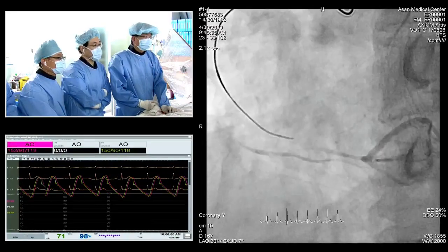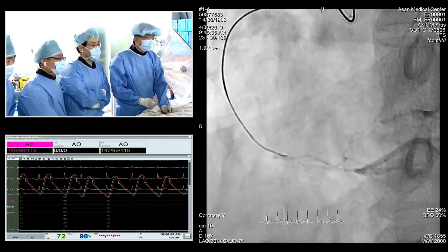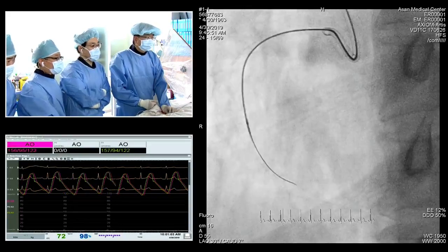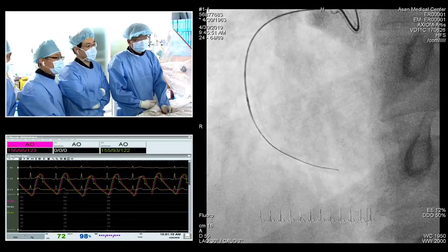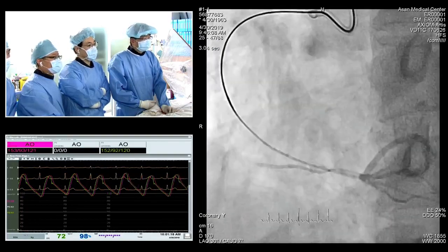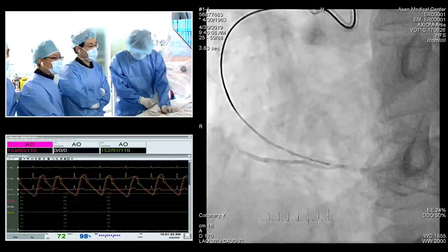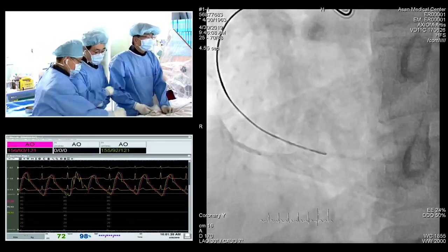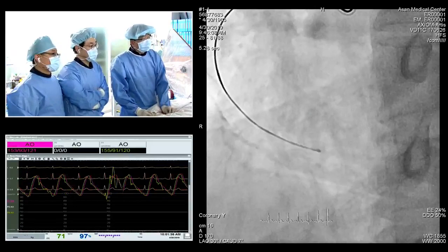Next. And at this moment, we check another projection. As you can see, there is some touching of the distal cap. At this moment, we make the direction to the lower portion. Next. And rotating the wire tip and just pushing. So there is no resistance. Next. So we're checking the location of the wire, and then the wire goes down. So we wanted to insert the microcatheter. However, there is some resistance around the distal cap area. The microcatheter cannot negotiate the distal cap area. So we remove the microcatheter.